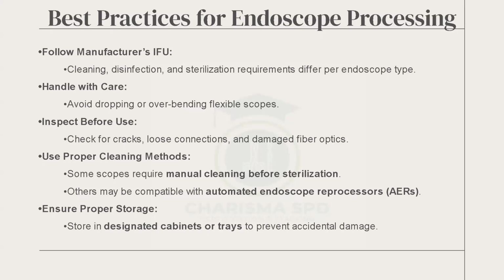That is what the IFU says. You have to disinfect it. But when it comes to disinfecting of scopes, we will have to pay attention to certain rules. When we get there, we'll talk about it. Those ones are stored in cabinets. That's why it's talking about designated cabinets or trays to prevent accidental damage.